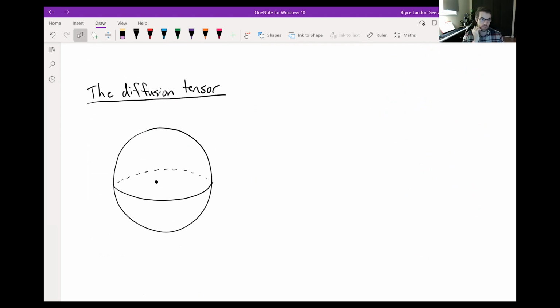So it's not that useful when we want to understand water diffusion in the brain, because like I said, under diffusion conditions or diffusion motion, water has an equal likelihood of moving in any direction unless those barriers exist. And if we're able to quantify how much diffusion we see in any given direction, we can get an idea of where barriers exist to diffusion, and that lets us investigate white matter in the brain.